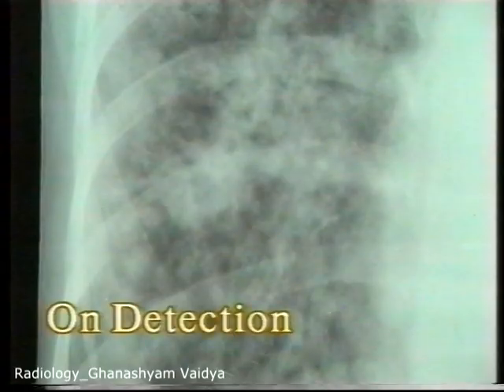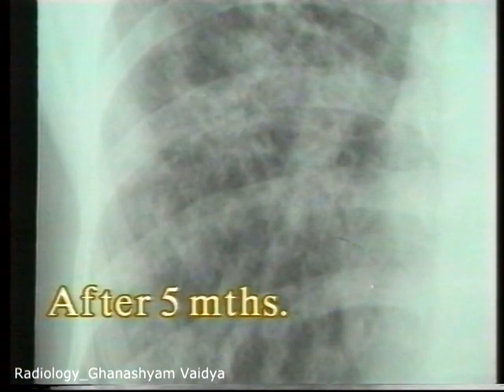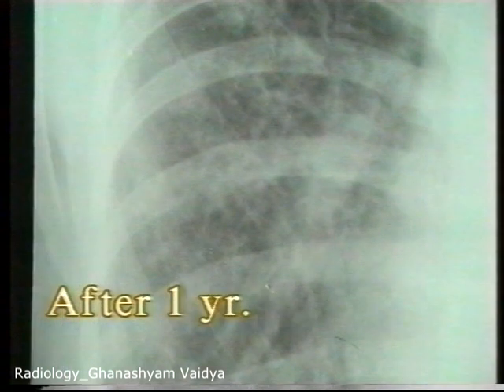Now let us see in close-up the right mid-zone of the same X-ray. Note the infiltration in the first X-ray. Then note the fibrosis and resolving infiltration in the second X-ray after 5 months, and the fine fibrotic streaks in the final X-ray.